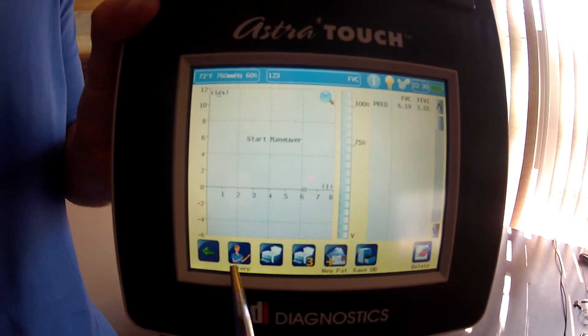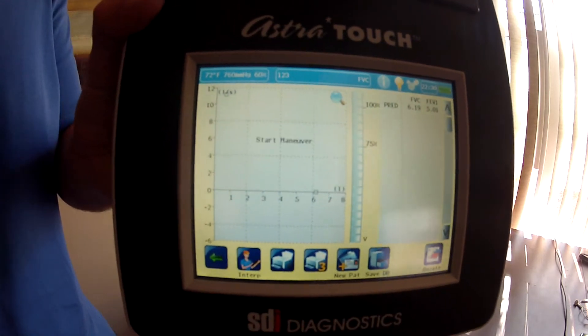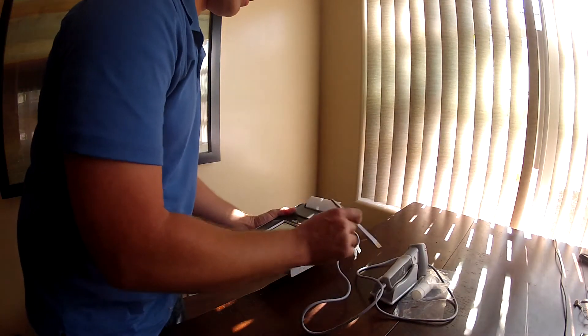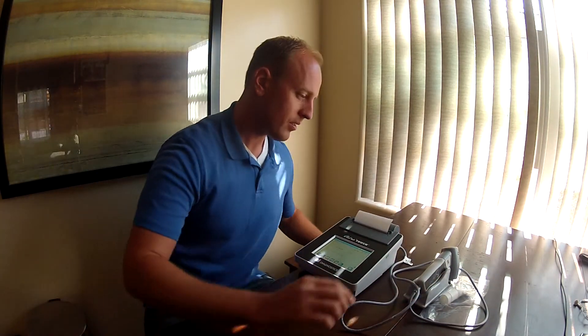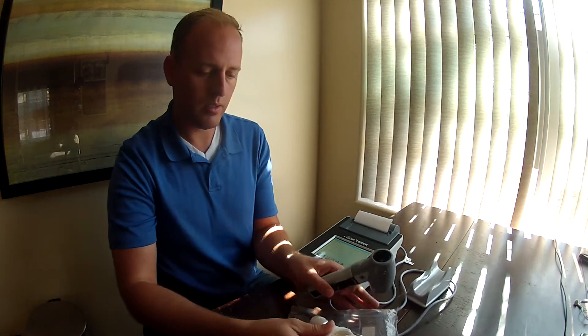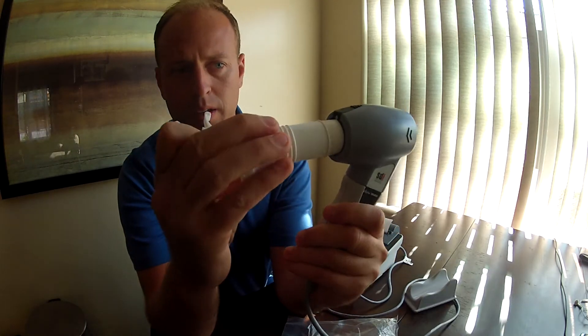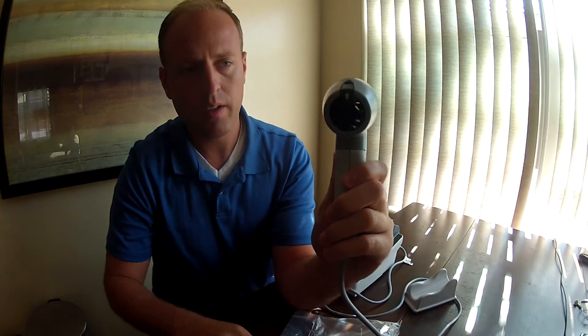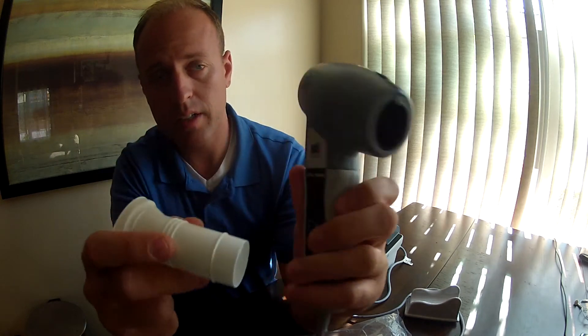I'm going to go ahead and start by blowing into the device. We take this part and the mouthpiece — you can't put it in the wrong way. There is a little nipple that doesn't allow you to insert the device on the wrong side, so it only goes in one way. It's foolproof.